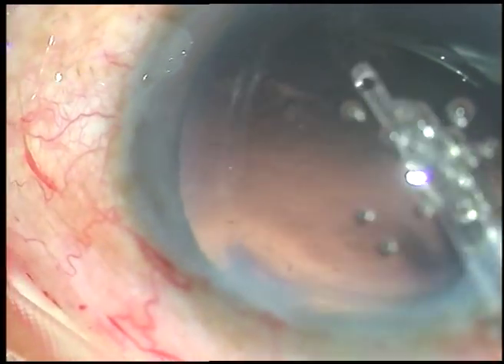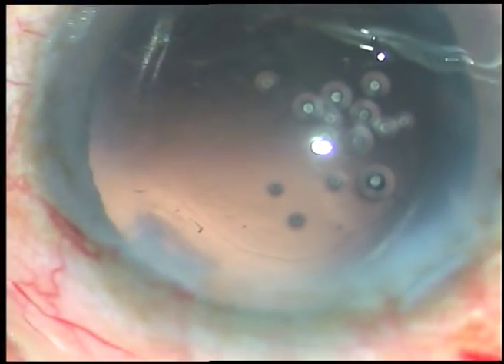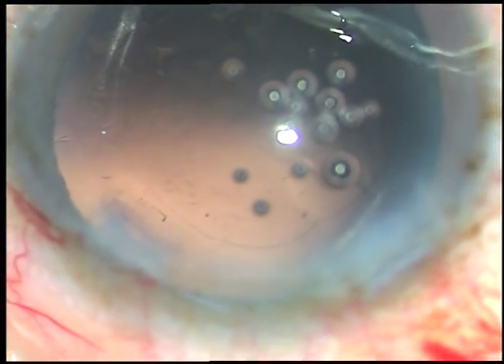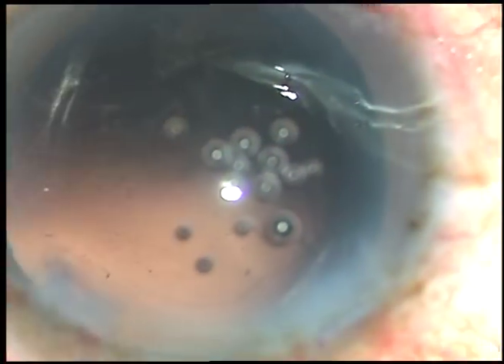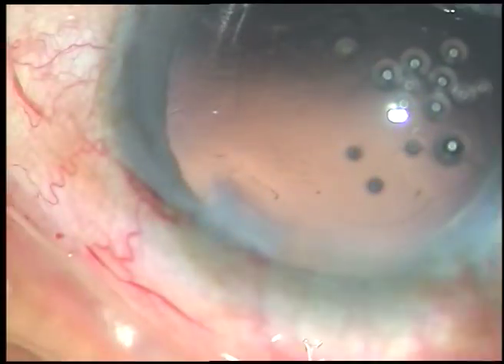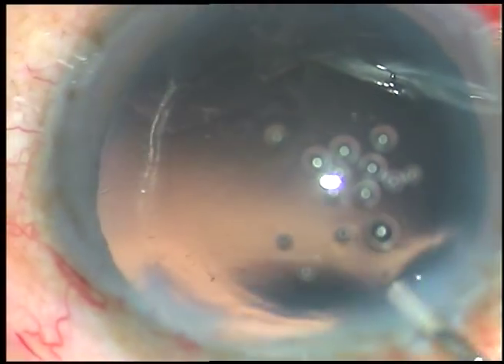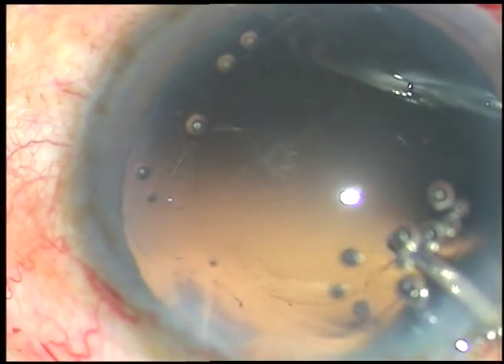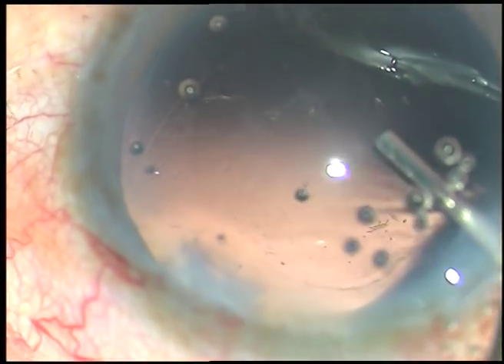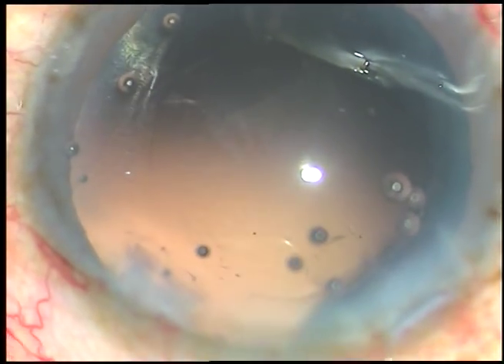So the main reason of zonular dialysis in this case was improper hydrodissection. Hydrodissection was not adequate, and I didn't bother to rotate the nucleus and epinucleus before starting to manage the nucleus.